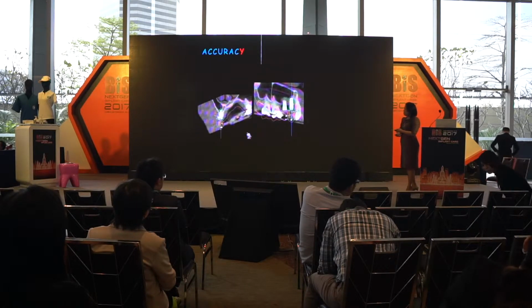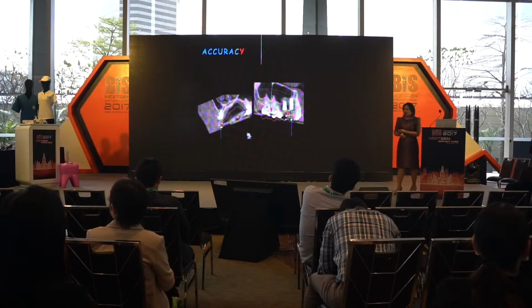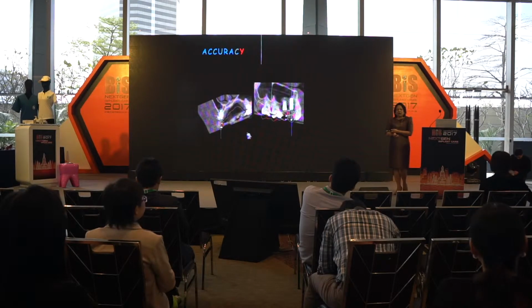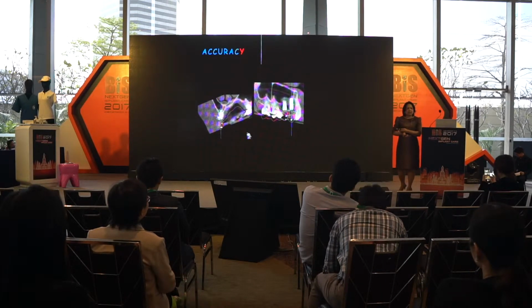Another reason is accuracy. In some cases, you have many implant placements and you need them to be parallel or aesthetic. You do not have enough room for error. That's why a little error can make an aesthetic failure.